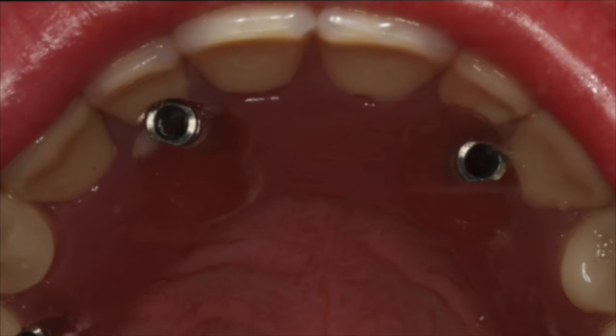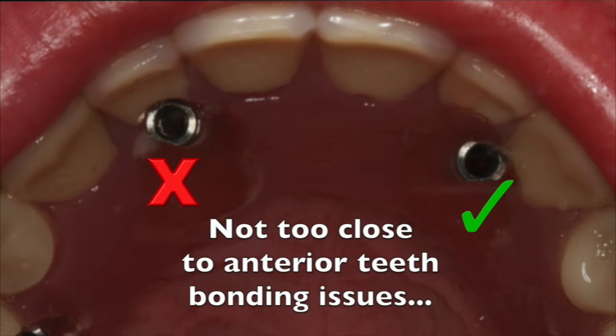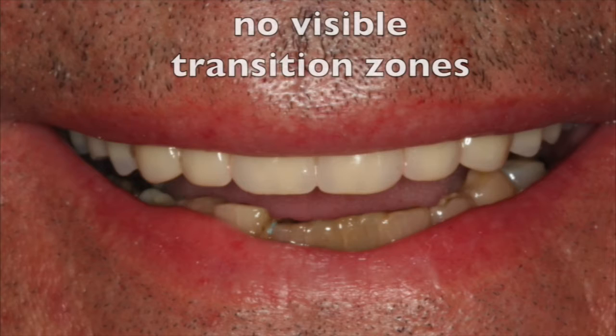We also want to plan so that the cylinders have acrylic in front of them so that we're not cutting into the anterior teeth, and trying to keep some acrylic so that these teeth can be really well bonded in. That's always important when we go to make the bars — to have some space for acrylic. Ideally there's about three millimeters of acrylic around the bar so that we have maximum strength for a hybrid prosthesis.